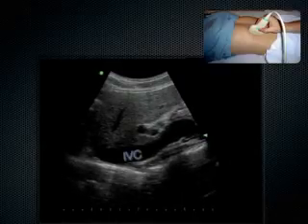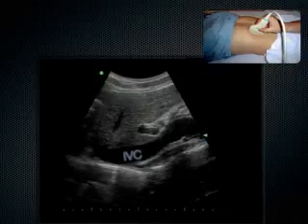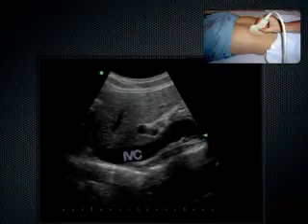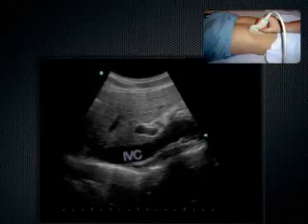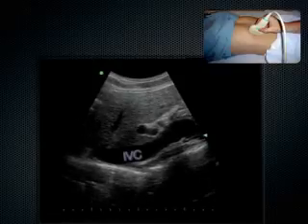So if I have somebody who's got a lot of respiratory distress, I'm debating between a PE and pulmonary edema, and this is something that would lean me towards either one of those diagnoses. To differentiate between those diagnoses, I want to look for the signs of pulmonary edema on ultrasound, which are B lines. We're not going to talk about that right now, but that's just something that we could also do at the bedside.